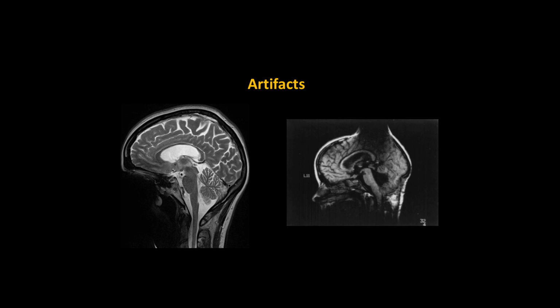Second one, and Bennett, I don't want to hear your interpretation of what's going on here, but I'll just tell you, this had to do with a hair tie that had some metal in it. So it's not the case that this person actually had a hole in their skull. We just happened to catch it with an image. But it leads to some distortions, and it makes it look as though something is there, but it actually is not.